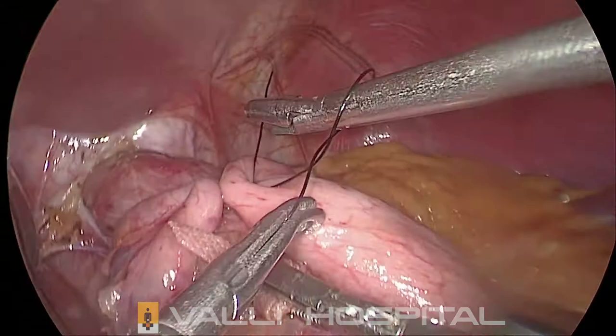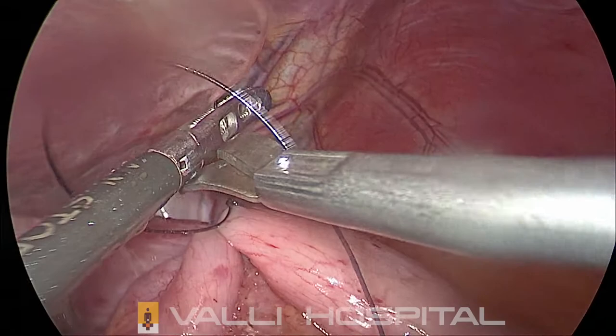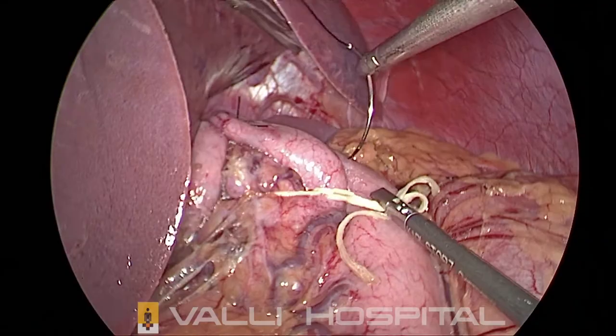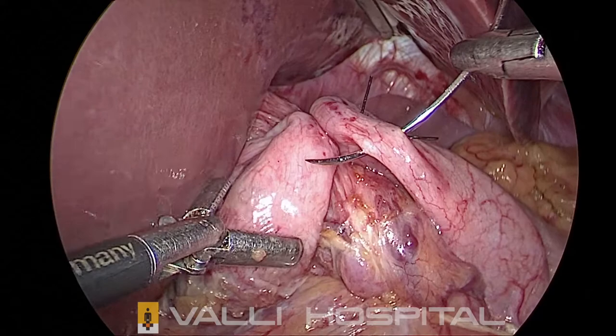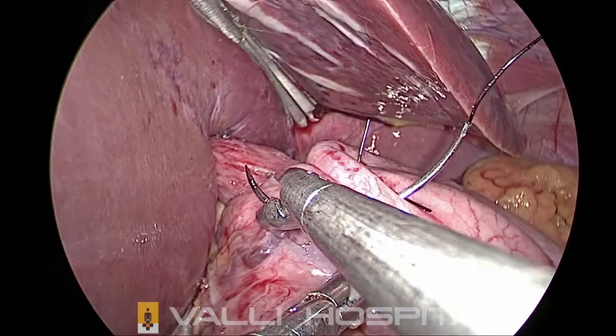Four or five knots you need to do if it is a monofilament. Cut it. Don't leave any thread longer. The next bite is not a U bite, it is a straight one below the U stitch. This has to be taken closer to the previous stitch. It should not come too low. Single stitch only, so that the wrap is only 2 cm.